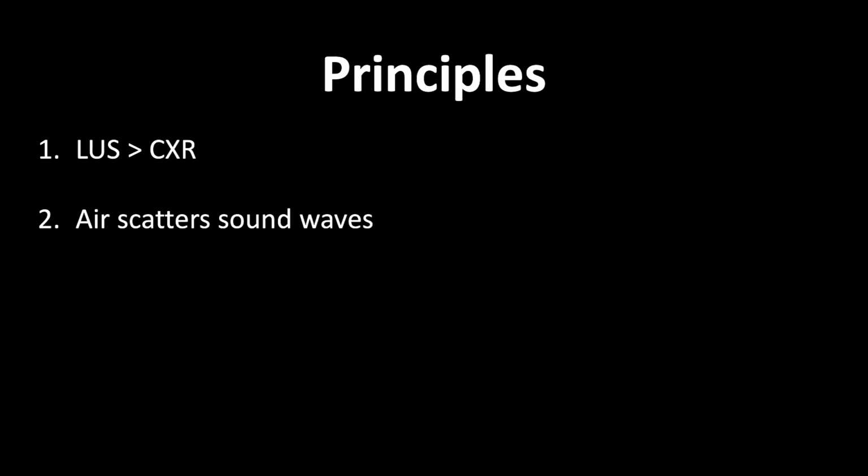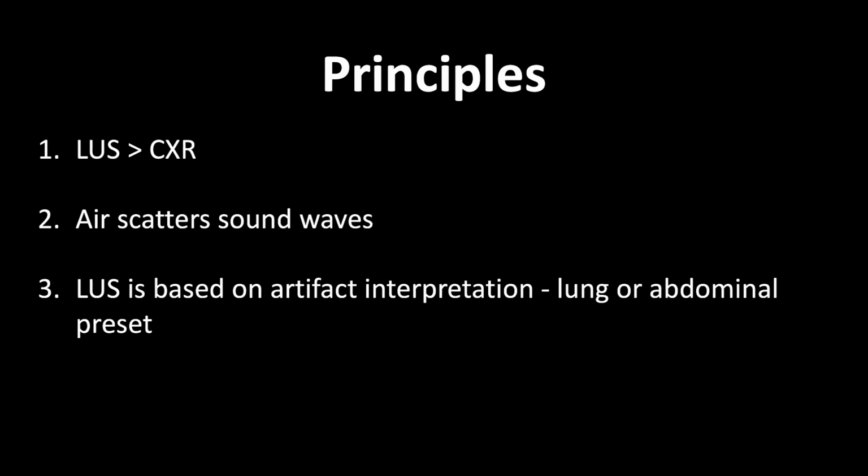Remember that ultrasound transmits and receives sound waves to generate images. However, sound waves are scattered by air, which normal lung is full of. Thus, lung ultrasound is based on the interpretation of artifacts that are generated when air scatters ultrasound sound waves.